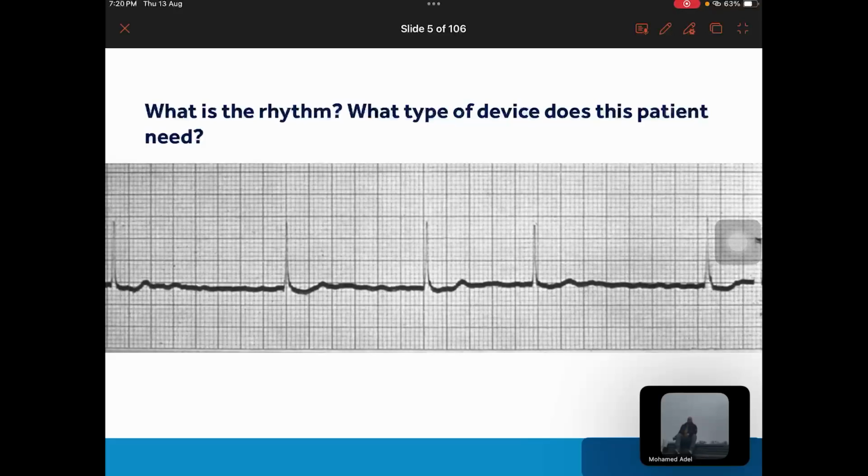Even if the patient is not young, left bundle pacing will minimize dyssynchrony, and you make the patient synchronized, not having RV induced cardiomyopathy later on. This is the trend every time.